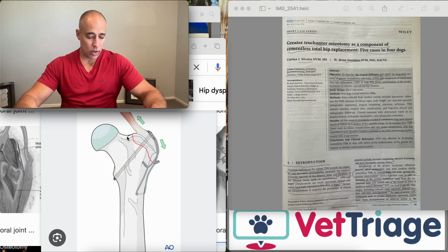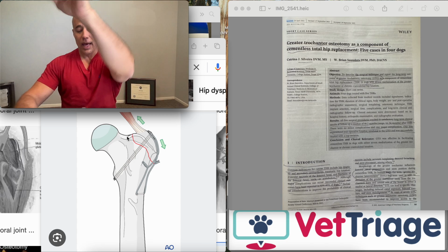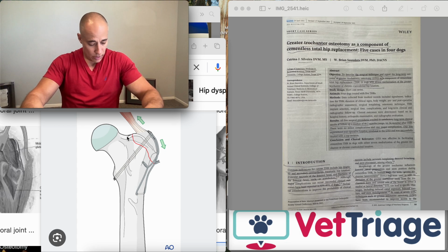Materials and methods. 3 dogs had severe medialization of trochanter. 1 dog had a chronic craniodorsal hip luxation of 2 years duration. Severe trochanteric medialization is defined as a femur in which the medialmost aspect of the greater trochanter was positioned on or medial to the anatomic axis of the proximal femur. So let me show you here some x-rays. They measured the anatomic axis of the proximal femur and then decided that the greater trochanter was in the way. They also saw in one of these cases concurrent proximal femoral sclerosis.